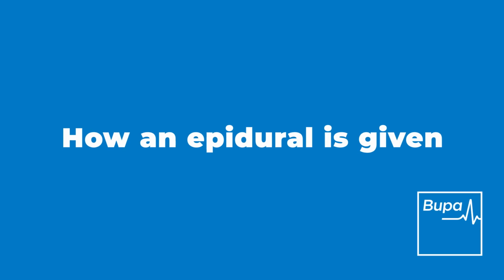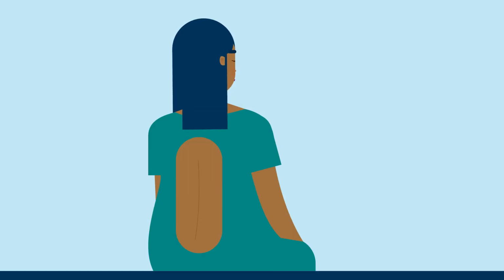How an epidural is given. An epidural is an injection into your lower back that temporarily blocks pain from your waist down.